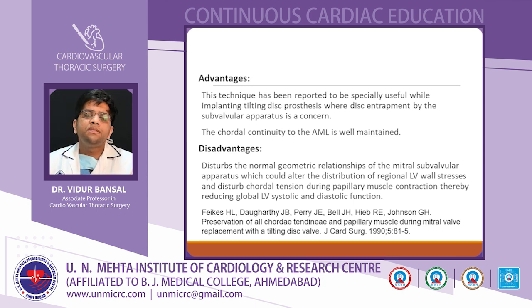The disadvantage of this procedure is that it disturbs the normal geometric relationships of the mitral subvalvular apparatus, which could alter the distribution of the regional left ventricular wall stresses and disturb the chordal tension during papillary muscle contraction, thereby reducing the global LV systolic and diastolic functions.